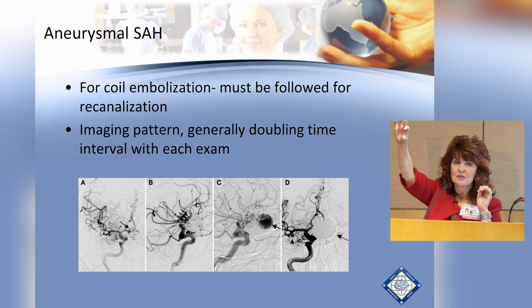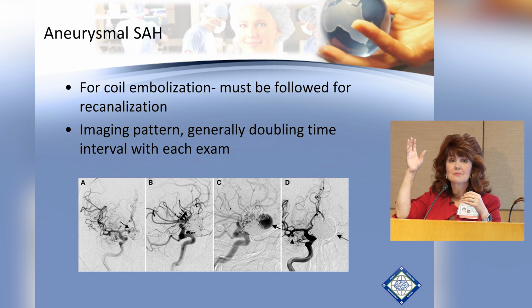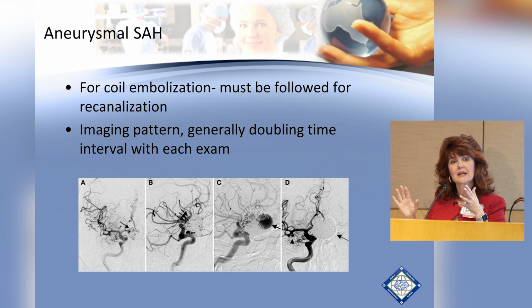And so it completely diverts the flow in the correct direction away from the aneurysm. And then the aneurysm over time just shrinks. It's really a beautiful, very elegant treatment. And so I think that going forward, as we gain more experience with that, you may see more and more people being treated with flow diversion.